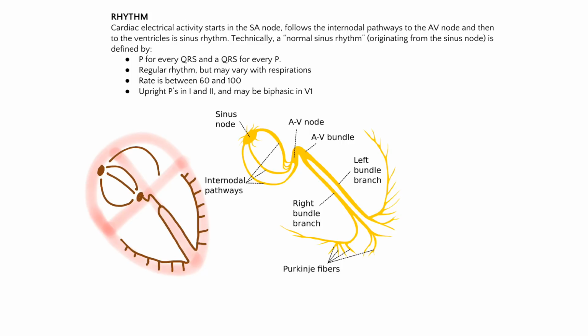Welcome to the second video, and here we're going to talk about rhythm. And what we mean by rhythm is, where does the conduction start? What is generating the rhythm here? And so you'll remember, you were taught this conduction fiber system.